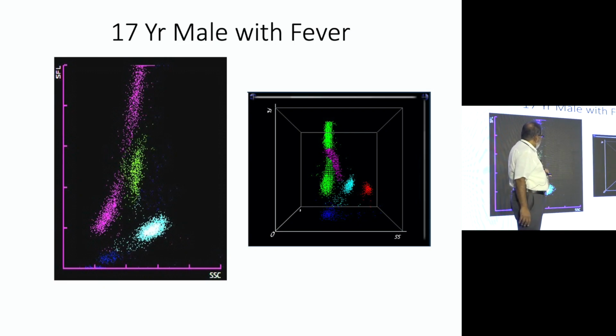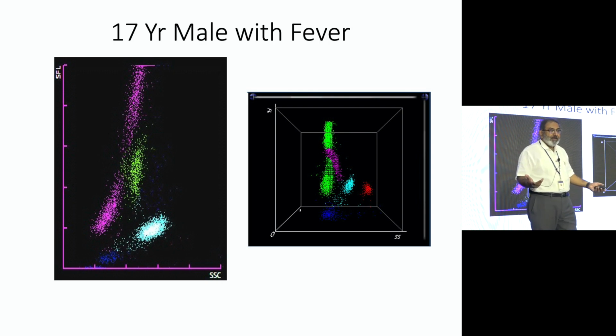So these are monocytes which are infected by dengue virus. According to Raymond, it's not monocytes, they are lymphocytes. It's all right. But you must realize, why does this pattern look like this? Normally when you have reactive lymphocytes, they should go like this. And you can see there are so many cells which have so much RNA that they are not even counted by the cell counter.